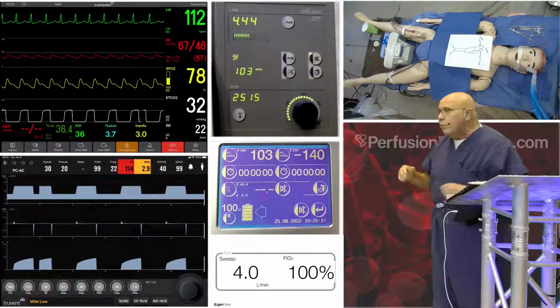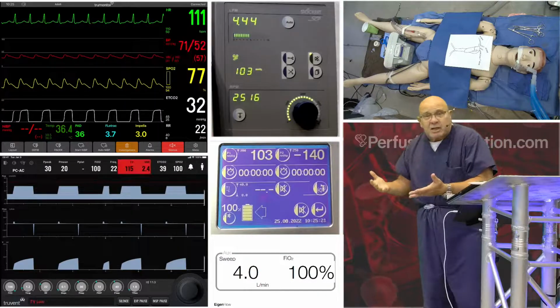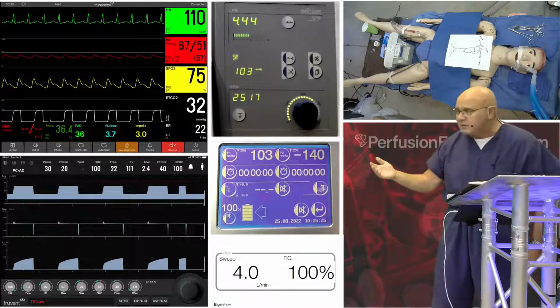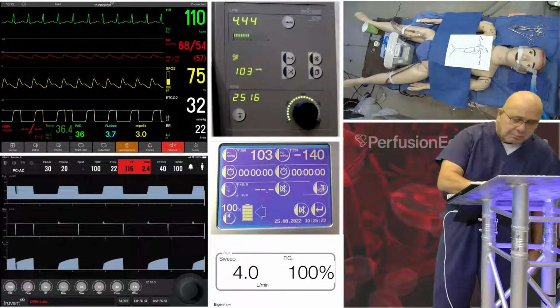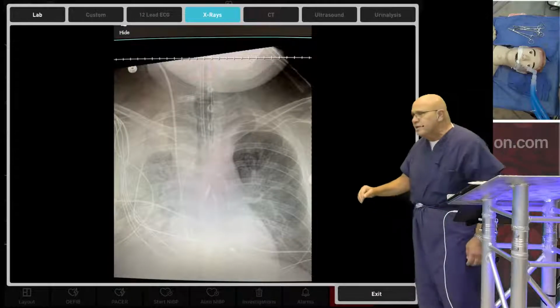So why is this happening? Let's try to understand that. This didn't happen yesterday. What happened in the meantime? So let's get a chest x-ray, would be the next most appropriate thing to do in this case. And let's make the chest x-ray big.